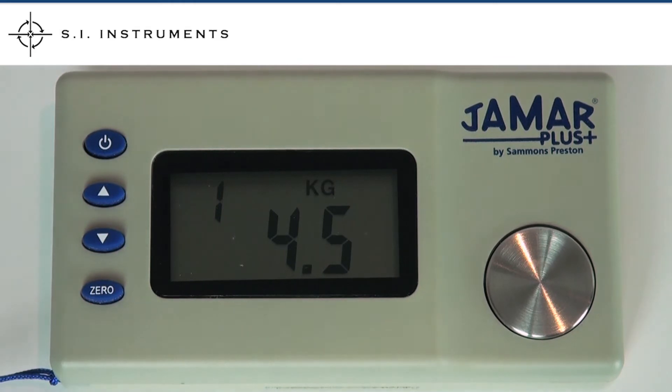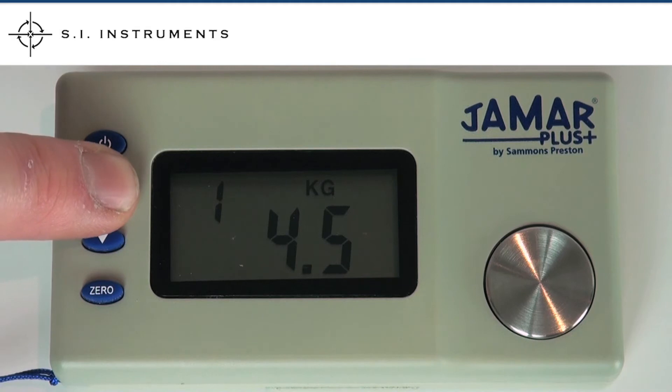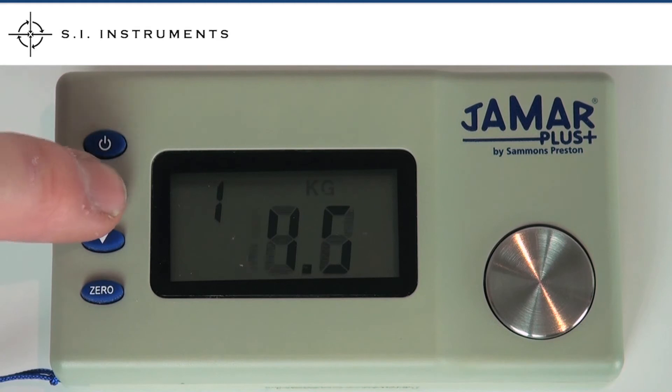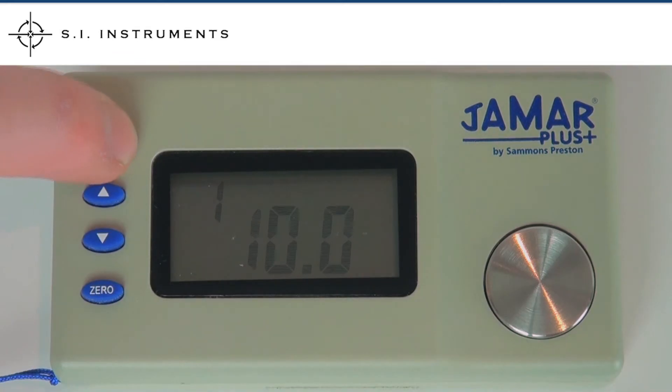It is possible to convert the JMR Digital Pinch Gauge to pounds. To do this, simply press the up button until the unit of measurement starts flashing. You can now toggle between the two. To confirm your selection, turn the unit off then on again.